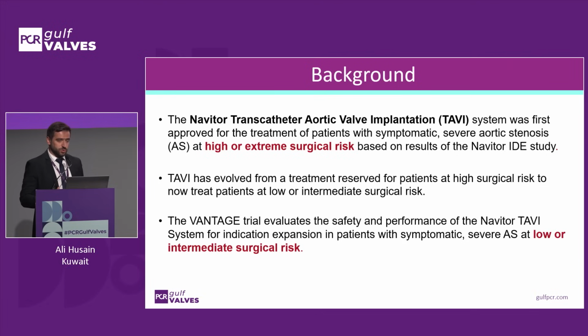Now we have evidence to treat asymptomatic severe aortic stenosis with TAVI based on the EARLY TAVR trial. Also, the age cutoff for doing TAVI has been reduced recently based on the new guidelines. So it's really important for the Navitor valve to be tested across all surgical risk profiles. And this was the question of the Vantage trial.